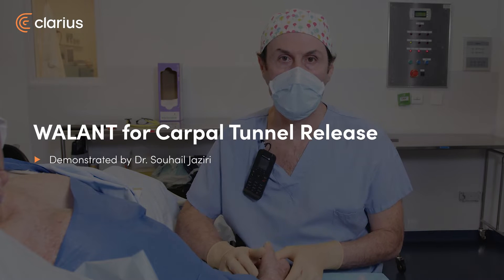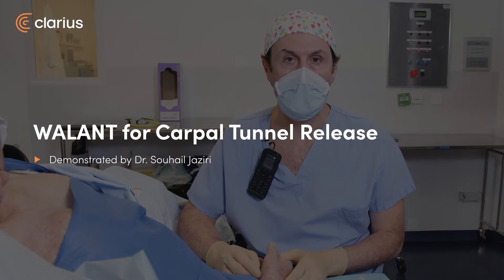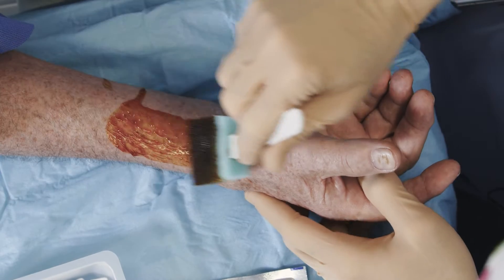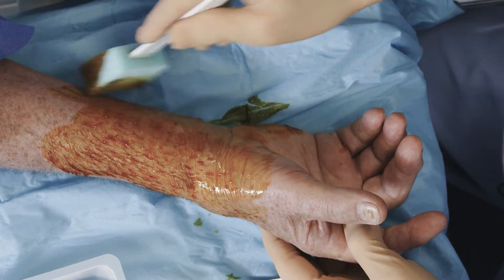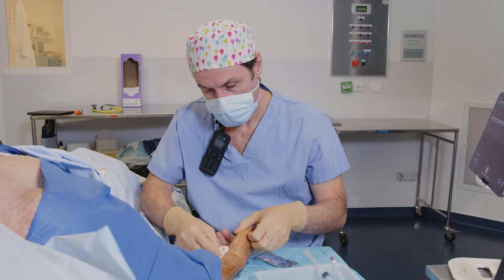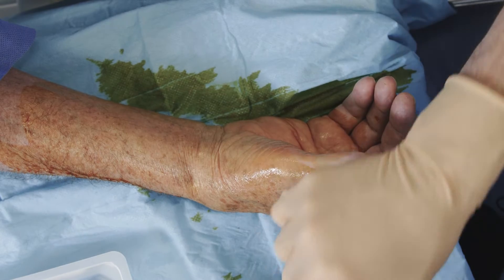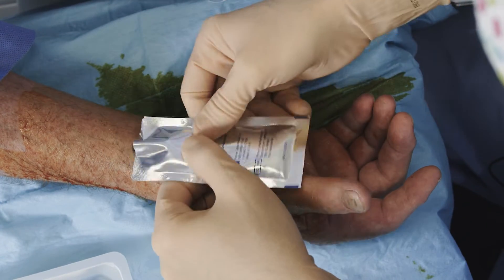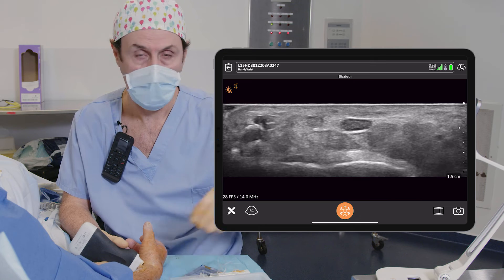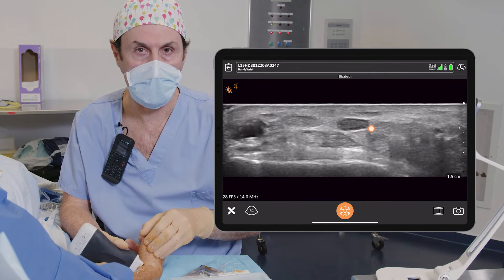Hi, I'm Dr. Jaziri. I'm an anesthesiologist. I will do today wide awake anesthesia for carpal tunnel release. We see here the median nerve in the middle of the screen.